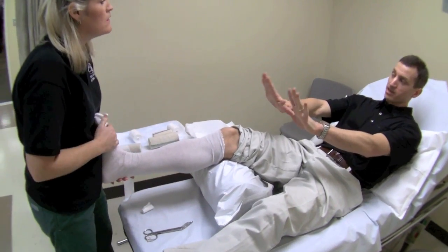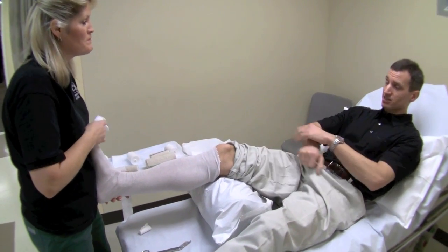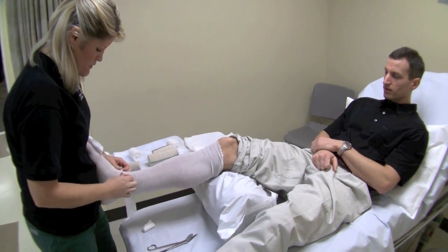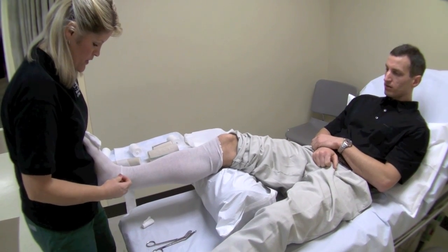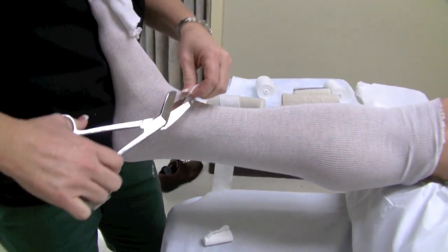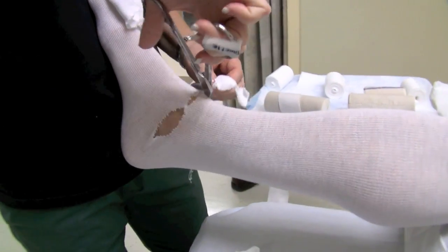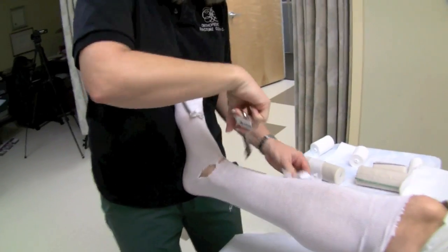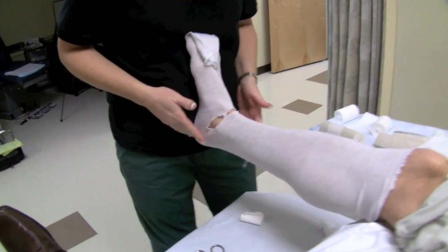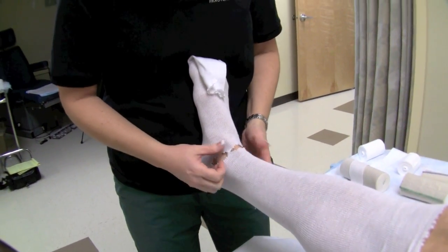The technician is bracing the foot against their body to keep it in the 90-degree position. Where the stockinette has a wrinkle, they cut out the wrinkle — every single one — so it's not putting any kind of pressure on the skin.